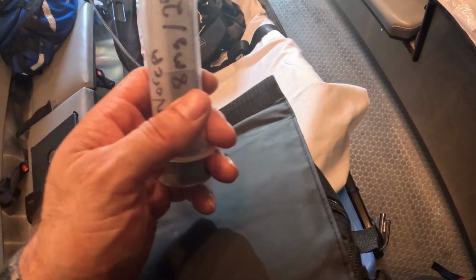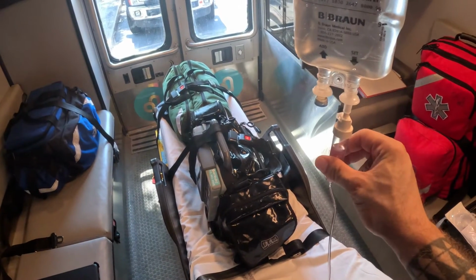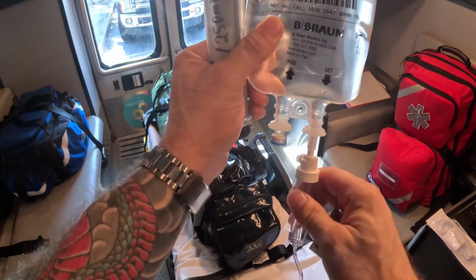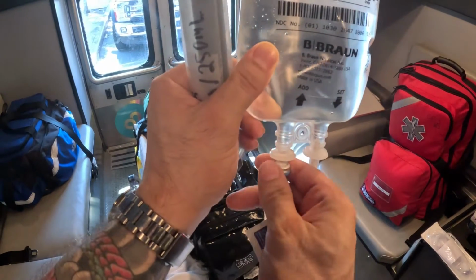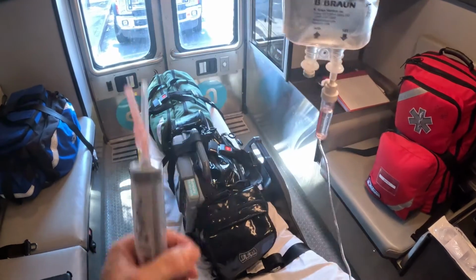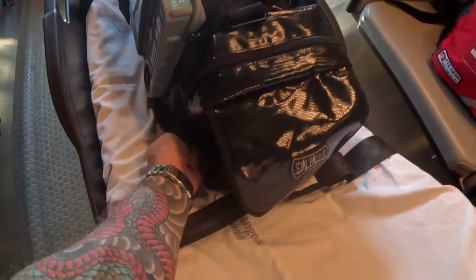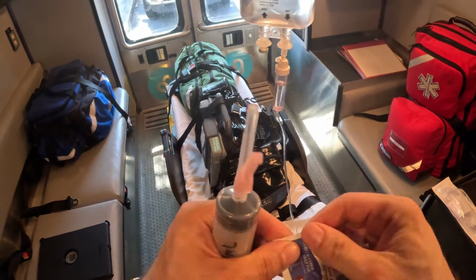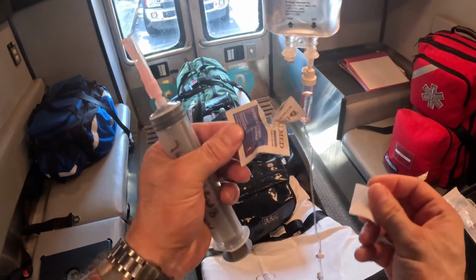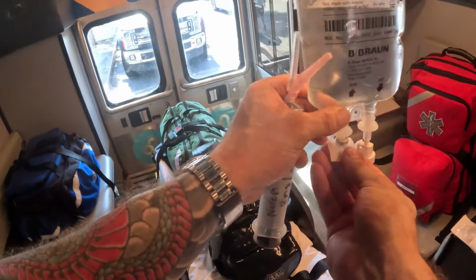And then what you're going to need is an alcohol swab. So if you come to this bag, usually all these bags have a port where you put your administration set, and here's where you add. You see it says add. This is for the set, and this is to add, but you could definitely pull your medicine from it. So I remove this, and then I take my alcohol right here, and then I swab.